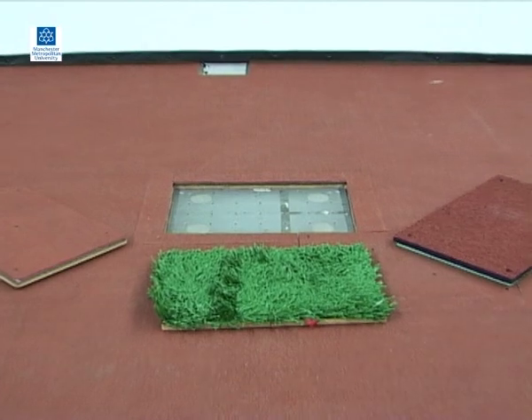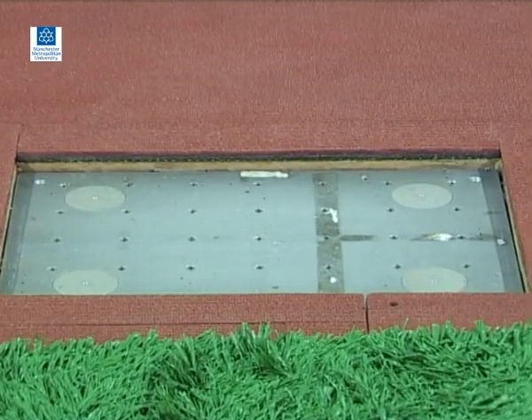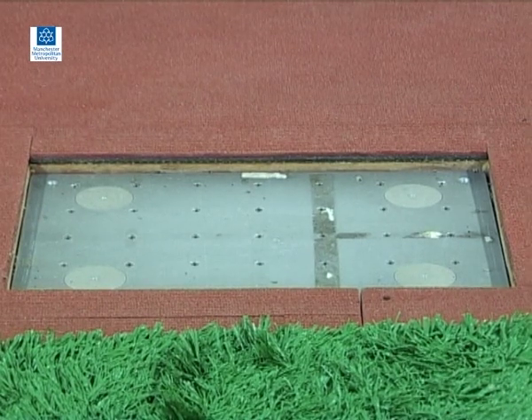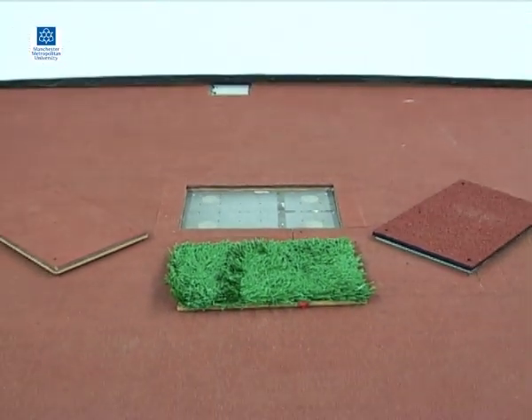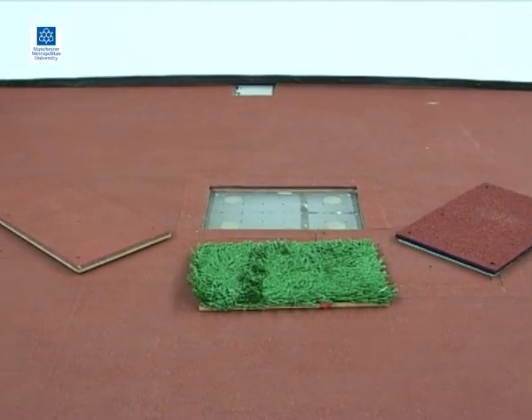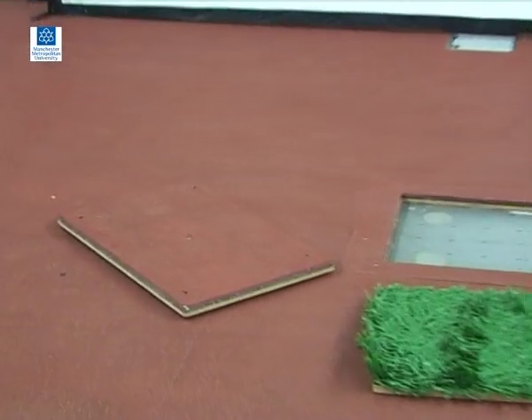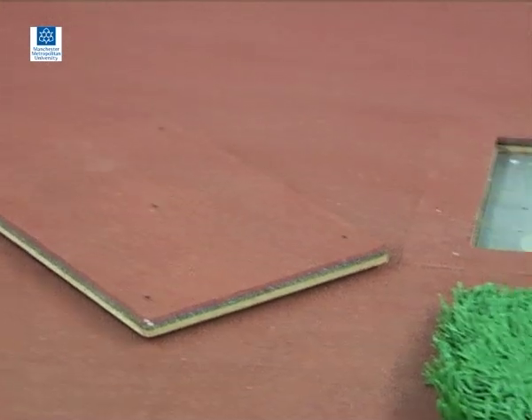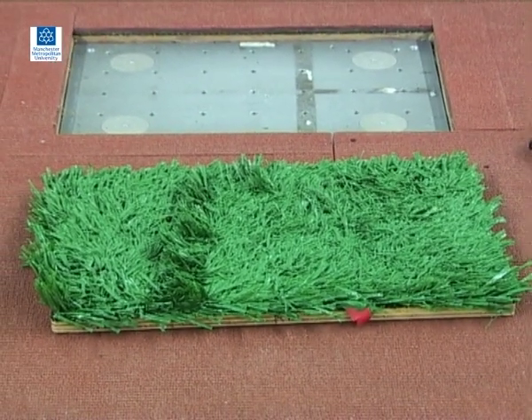Interchangeable surfaces allow for a surface to be installed that is suitable for the activity being analysed. For example, a synthetic grass surface for use when evaluating an AstroTurf trainer. The material properties of the surface covering the plate will affect the forces being measured. The cushioning properties of different surfaces can therefore be investigated during gait or impacts. Frictional properties of a surface can also be evaluated during, for example, cutting manoeuvres.